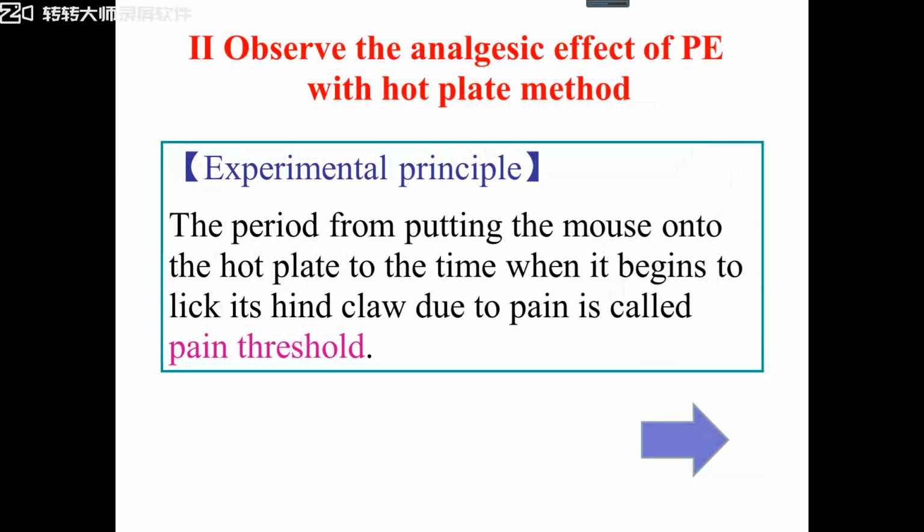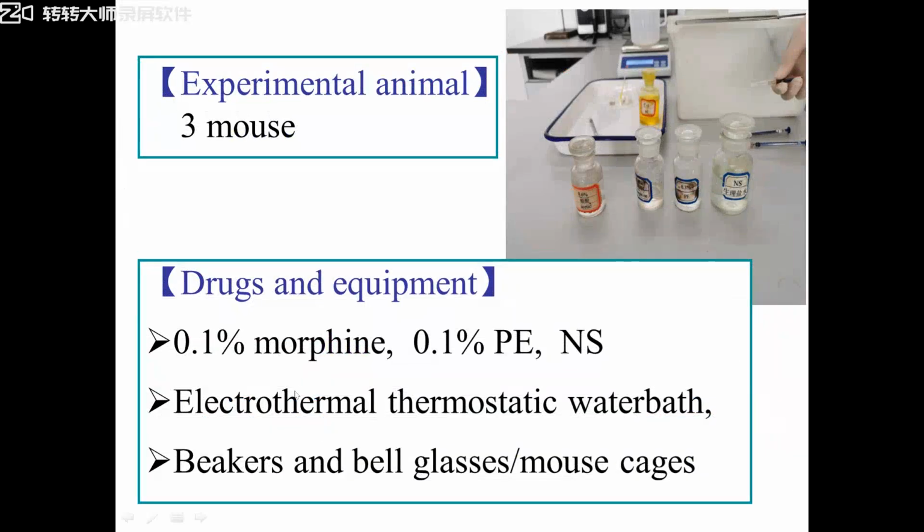Now we know the definition of pain threshold. This pain threshold means the period from putting the mouse onto the hot plate to the time when it begins to lick its hind claw due to pain. This period we call the pain threshold. So let's do the lab.